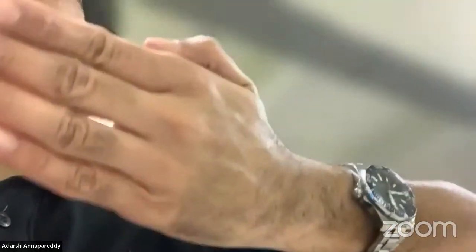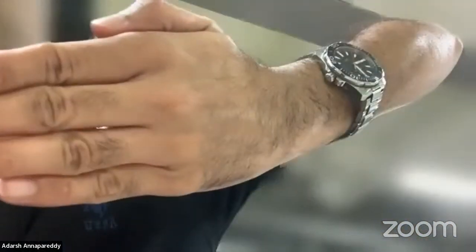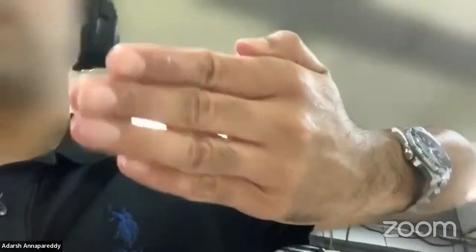So when you're using your saw, bring your saw down. Don't lift your elbow up. The moment you lift your elbow up, your saw goes deep, and then you'll end up cutting too deep. So you should come parallel down, like this.